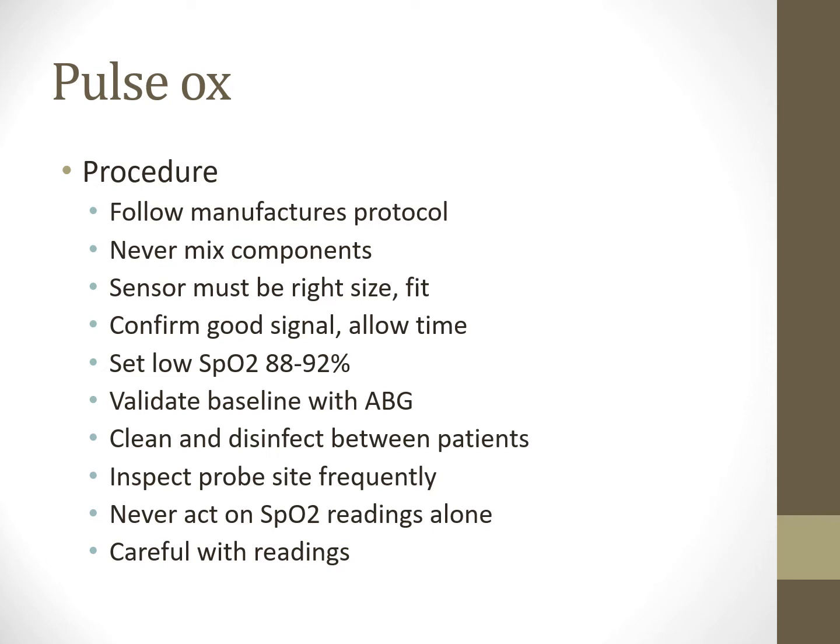Confirm a good signal, right? Allow time for it to read a signal and come out. One of my finger pulse oxes that I have, it takes about a good minute or so before it reads a good accurate heart rate. So it has to be given some time before it calculates, before its internal algorithm sort of reads that accurate heart rate. It looks at pulsatile flow, and then it recalculates, and then after a minute, okay, this is really what their heart rate is.